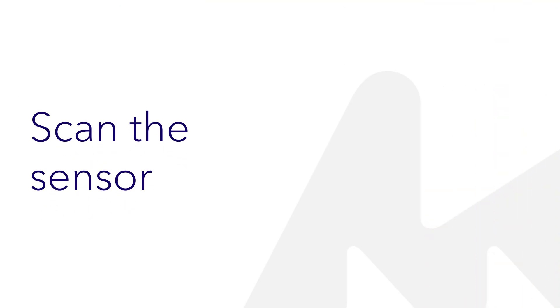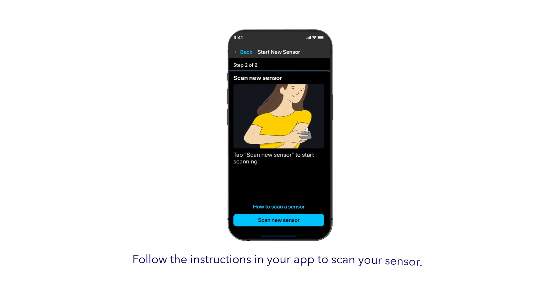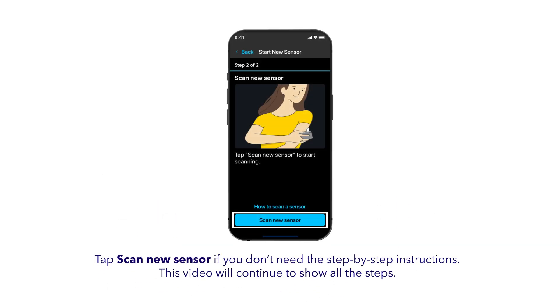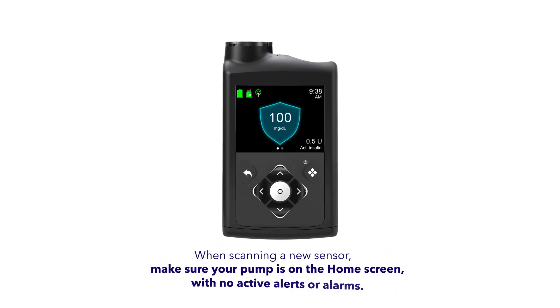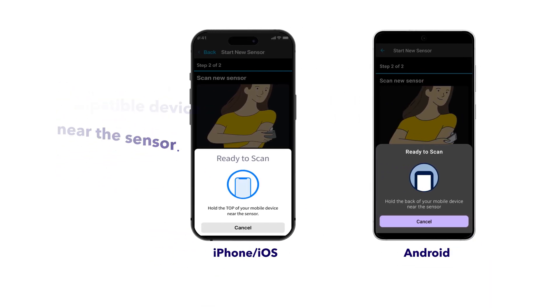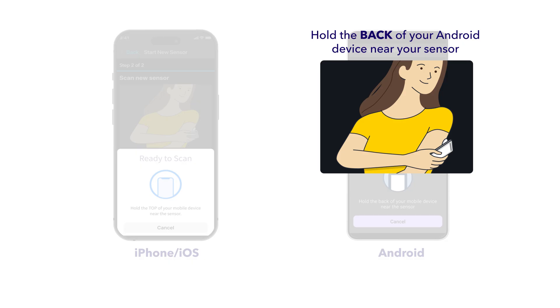After applying, it's time to scan your sensor. Tap Next in the app. You can follow the how-to scan a sensor steps in the app, which adjust automatically depending if you're using an iOS or Android device, or scan on your own. Make sure your pump is on the home screen with no active alarms or alerts. Then hold your phone near the sensor. If you're using an iOS device, hold the top of your device near the sensor. If you're using an Android device, hold the back of your device near the sensor.